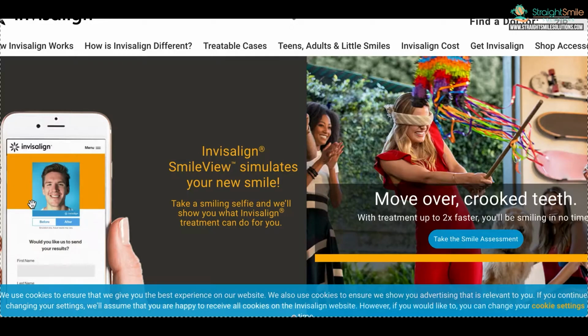If I were Invisalign as a company, I would probably make it free with the comprehensive cases, and I would probably charge for it with the other cases. I can't tell you what they're going to do, but given the tone of the answer on the webinar, I have a feeling that this is going to be a limited thing. So my concern is that you're going to be training your patients how to use this, getting them all to download this app, getting them all to register their personal information with Invisalign, which I know is going to be an issue.